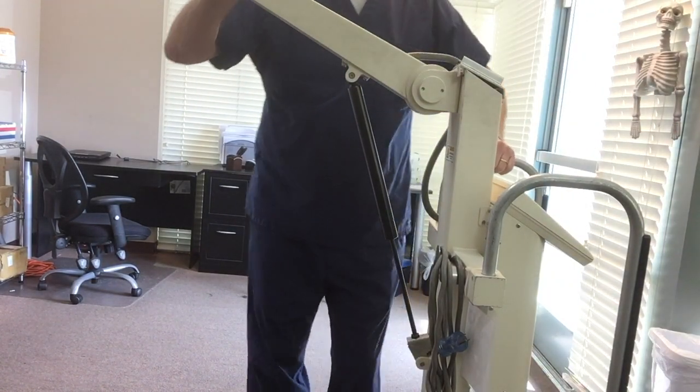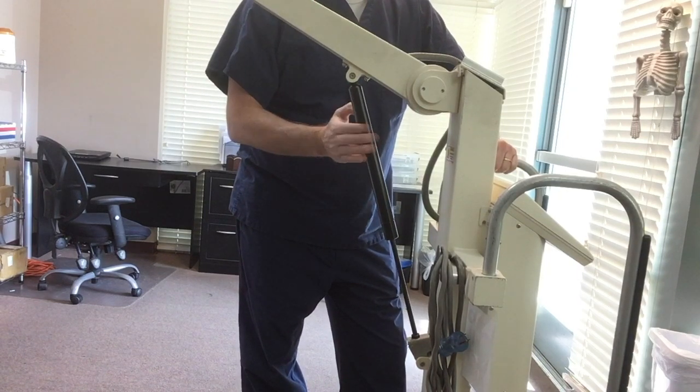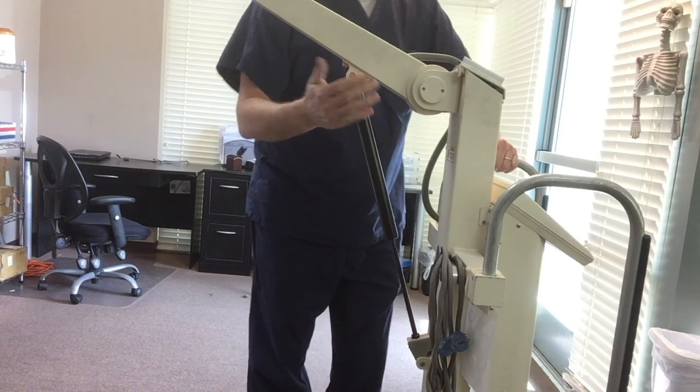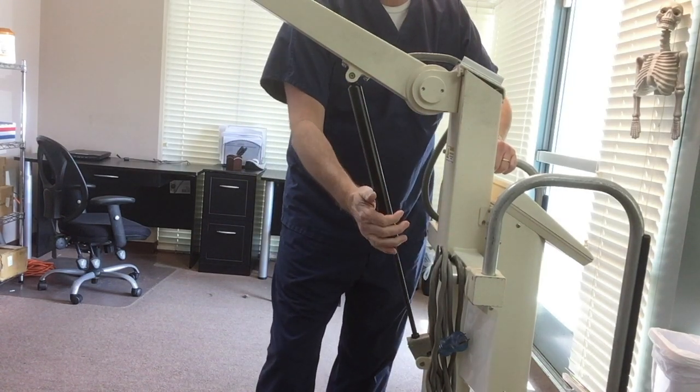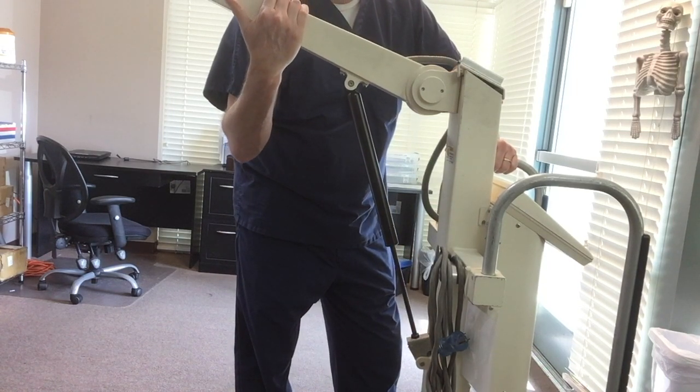Today I'm going to show you how to fix a leaky piston on a Sorcery 130 x-ray machine. The piston should only be able to go up or down when you use the button on the arm. This one, since the piston is screwed in too far, if I apply pressure to the arm, you can see the arm coming down.